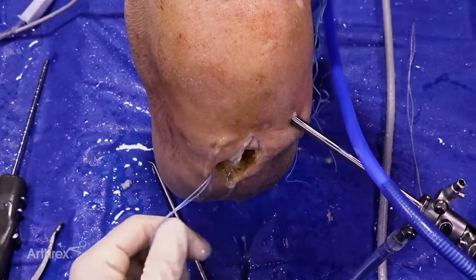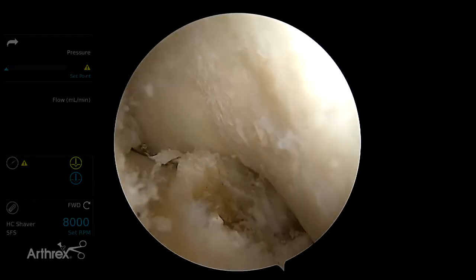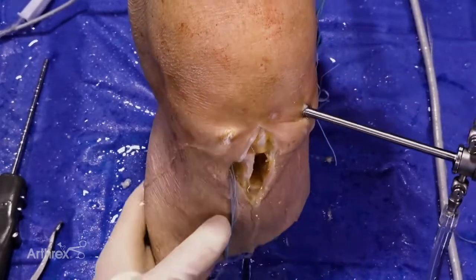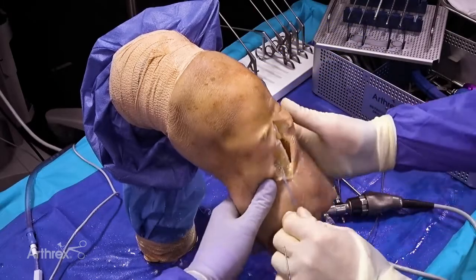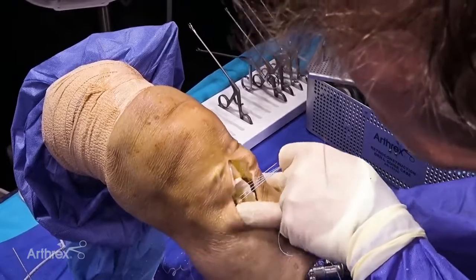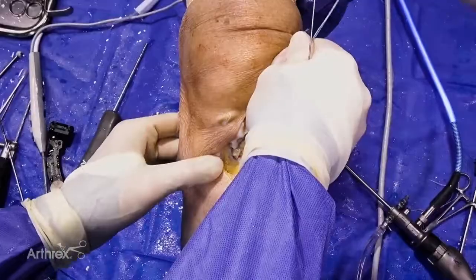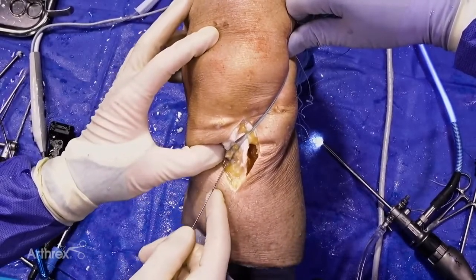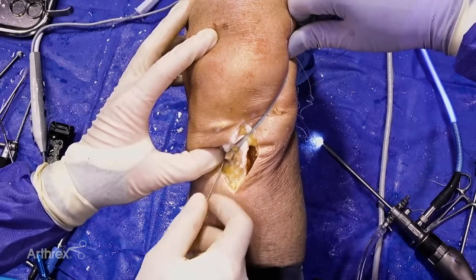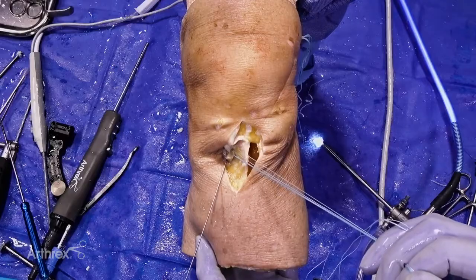Femoral fixation is completed. The ACL is in appropriate position; the knee is taken into extension demonstrating no evidence of impingement — the graft disappears appropriately behind the notch. We then move forward with tibial fixation using the biocomposite fast thread screw. The knee is placed in approximately 10 to 15 degrees of flexion and we check isometry of the bone plug in flexion-extension. Tensioning is mildly anisometric which is preferred. We have an intentionally long bone plug — approximately 30 millimeters — with about 25 millimeters inside the tunnel, leaving 5 millimeters outside to facilitate tapping and screw fixation.